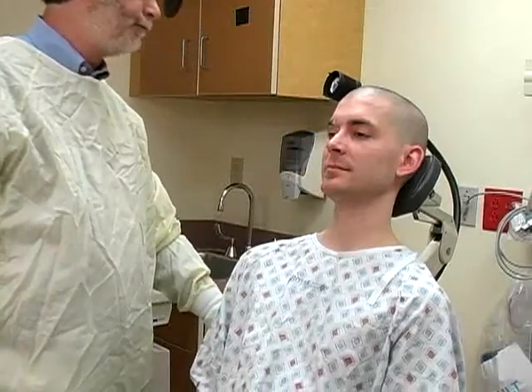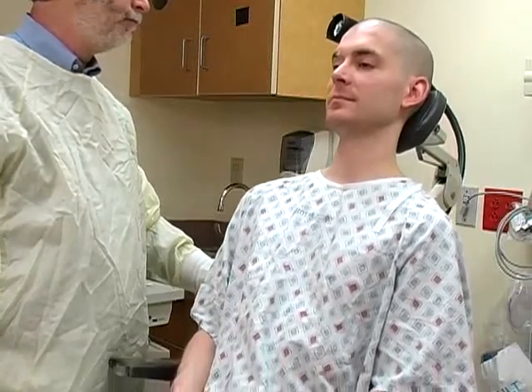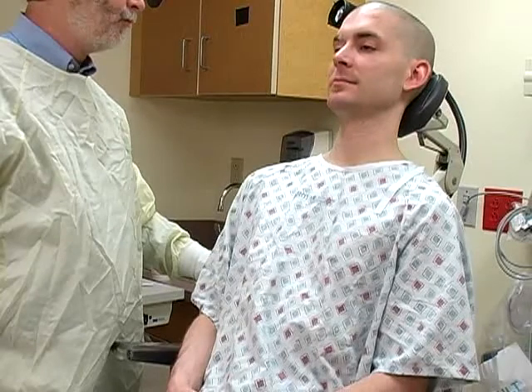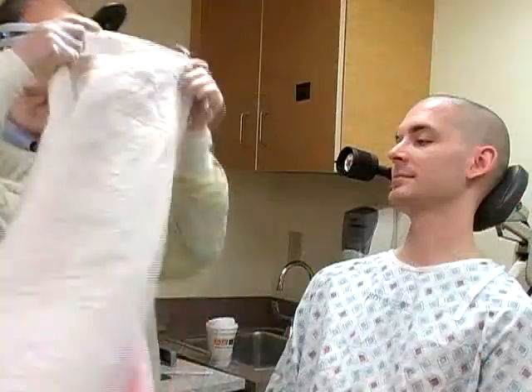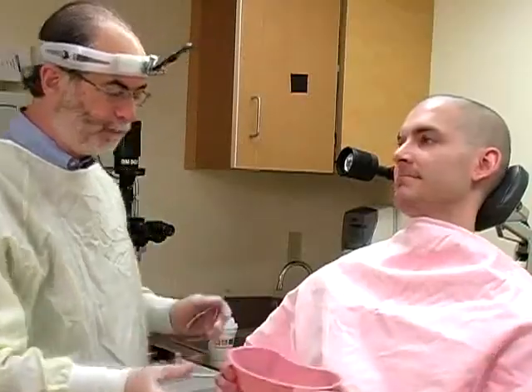Position the patient sitting upright, preferably in an ENT chair. Raise the patient so that his nose is approximately at your eye level, and position the headrest behind his occiput to prevent unexpected head movement. Place an absorbent pad over his chest and provide an emesis basin.